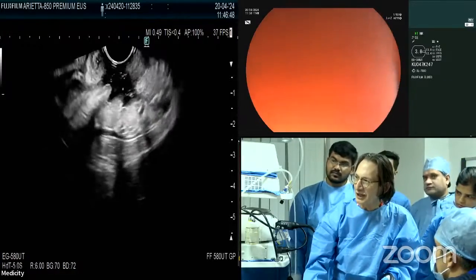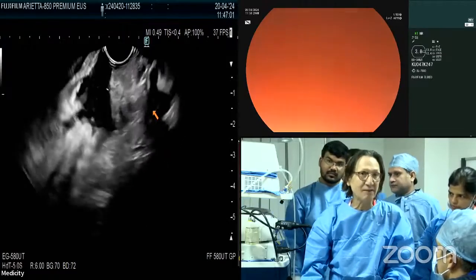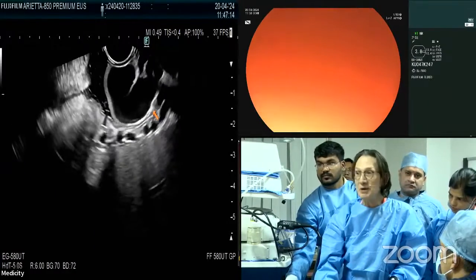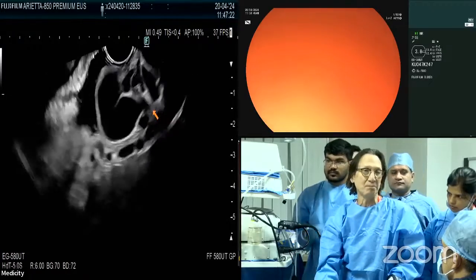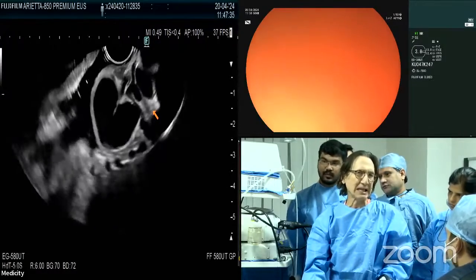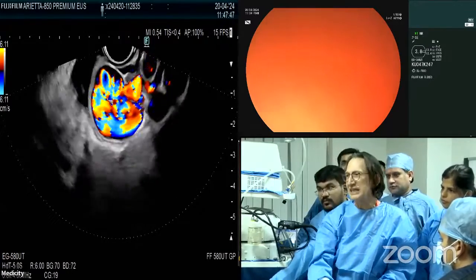Now I'm filling up the lumen and you can see — there's that big gastric varix, nice and clear. What you want is to really see the outline. You need to differentiate varices from collaterals: varices are intramural, collaterals are extramural. We don't want to be putting glue and coils into the collaterals. We want to look ideally for the feeder vessel, and we definitely don't want to be putting them into a big gastrorenal shunt. What may look endoscopically like one big varix may actually be a convolute of smaller interconnected varices — exactly what you see here.